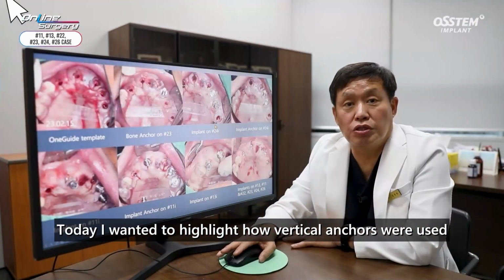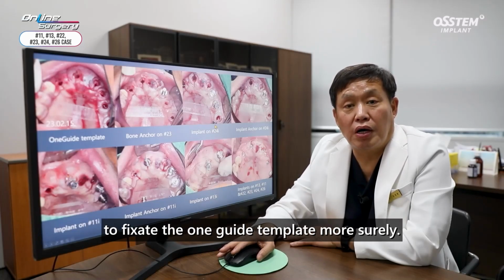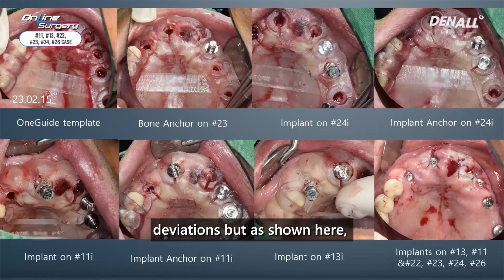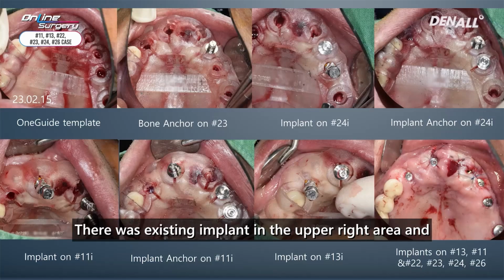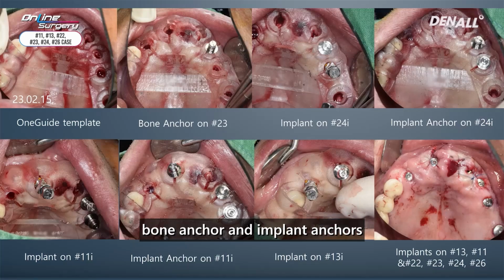Today, I wanted to highlight how vertical anchors were used in the case where there was distal free end to fixate the OneGuide template more surely. When you use lateral anchor, at times, because of compressed gingiva on one side, there can be deviations, but as shown here, in this case, I've used a bit more vertical anchors to highlight the importance of it. There was existing implant in the upper right area and on the other side, in a symmetrical manner, in the canine and premolar area, bone anchor and implant anchors were used to fixate the template better.